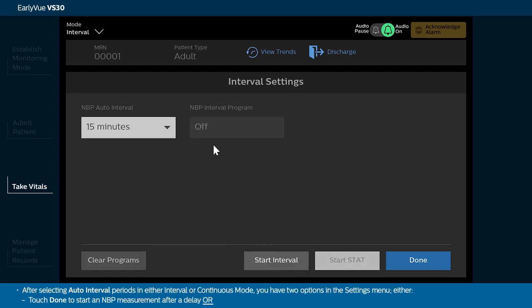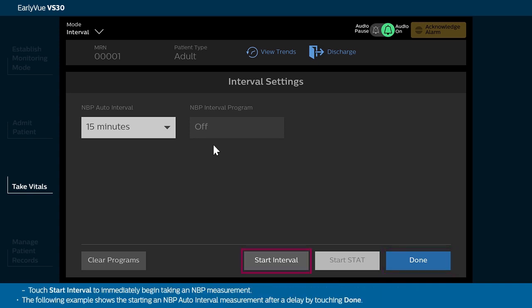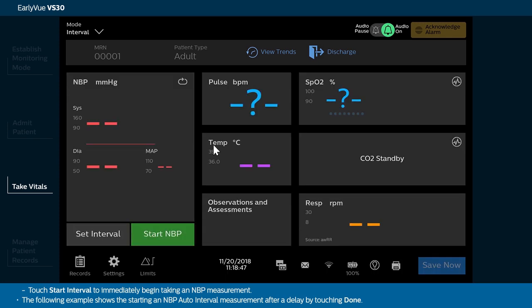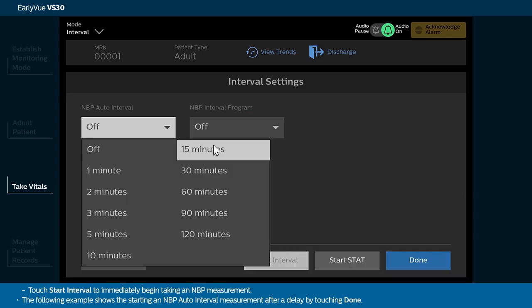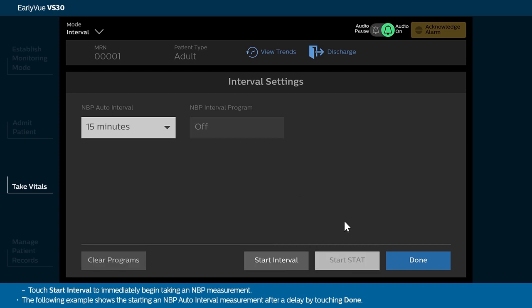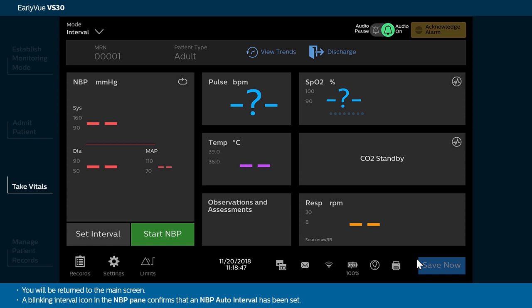After selecting Auto Interval Periods in either Interval or Continuous Mode, you have two options in the Settings menu: either touch Done to start an NBP measurement after a delay, or touch Start Interval to immediately begin taking an NBP measurement. The following example shows starting an NBP auto interval measurement after a delay by touching Done. You will be returned to the main screen. A blinking interval icon in the NBP pane confirms that an NBP auto interval has been set.